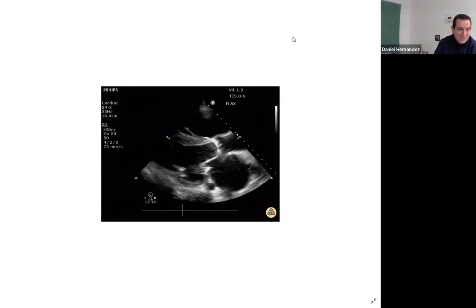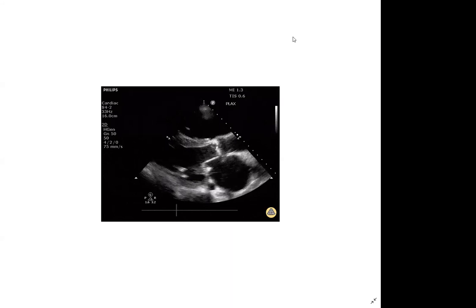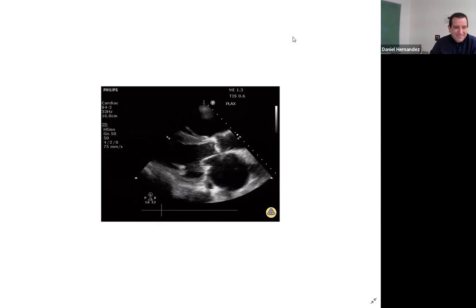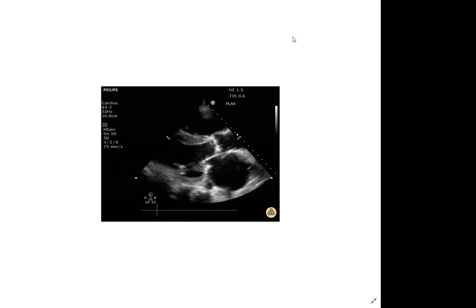You're on a roll. What else do you see, Rachel? I feel like the aortic valve is stenotic too. Absolutely. Looks like crap. It's barely opening. Definitely. What else? Come on. You got this. You're a cardiologist today.